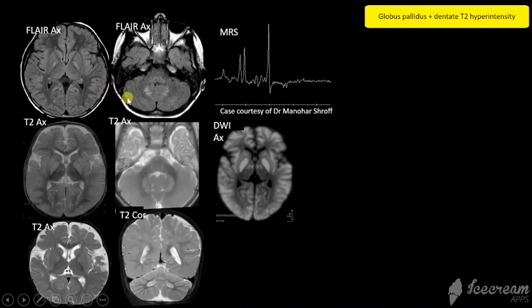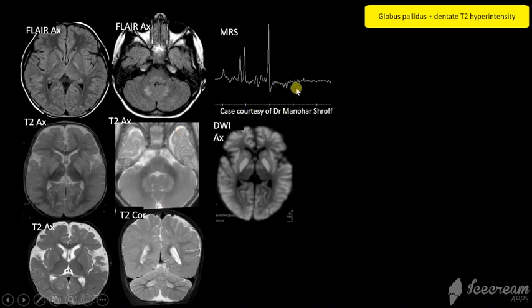Three different cases all with similar findings again. In addition to the globus pallidus signal changes, all three cases have symmetric changes involving the dentate nuclei. In the first case there is a lactate doublet at 1.3, so this is MELAS syndrome.